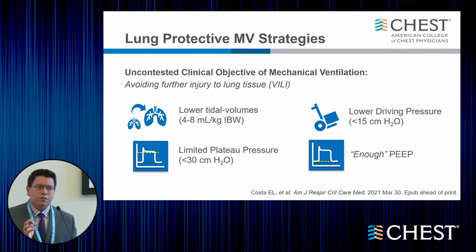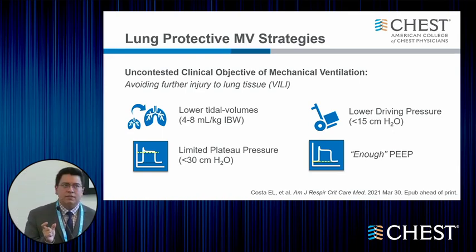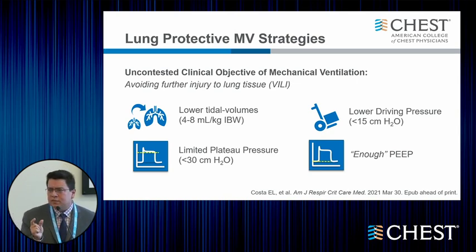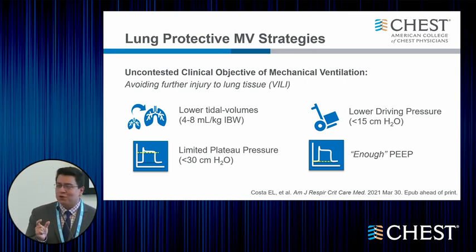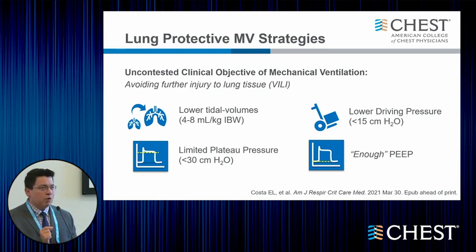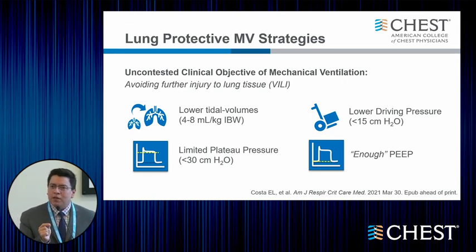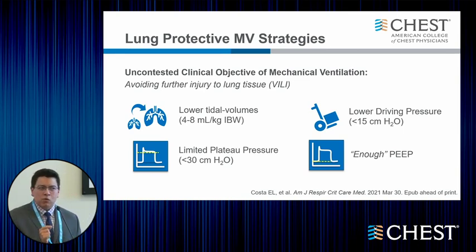We're always very cautious about the pressure that we allow at the end of inspiration under static conditions, and that is the plateau pressure. We try to keep it below 30 centimeters of water. And recently, since 2015, if we can still call that recently, we're paying attention to driving pressure, which is basically the difference between your plateau and your PEEP in volume control ventilation. And evidence has shown that whenever that pressure is 15 or higher, the mortality increases in patients who are mechanically ventilated with ARDS. And for the PEEP amount, the closest evidence base we have been able to achieve is calling it enough PEEP.